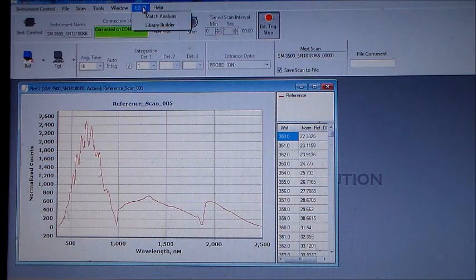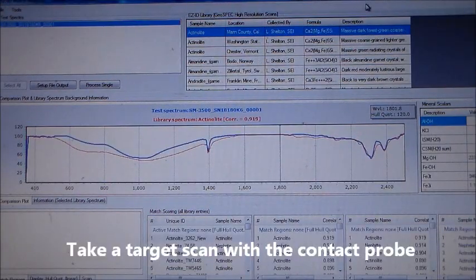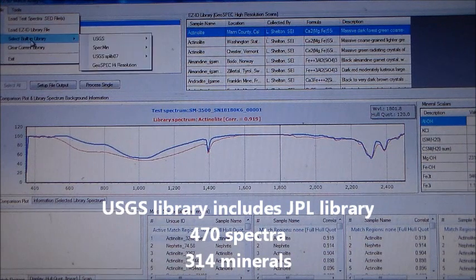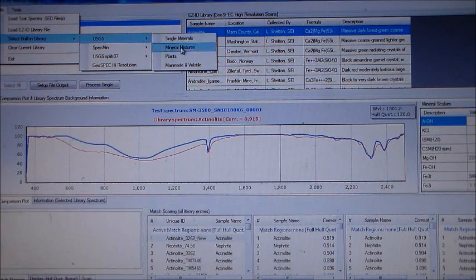Select EasyID Match Analysis from Darwin's menu, then scan a target sample with the contact probe. EasyID includes the USGS library for pattern matching against known samples. The USGS library includes the JPL library for a total of 470 spectra for 314 minerals.